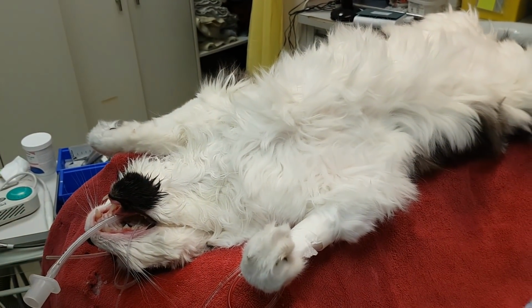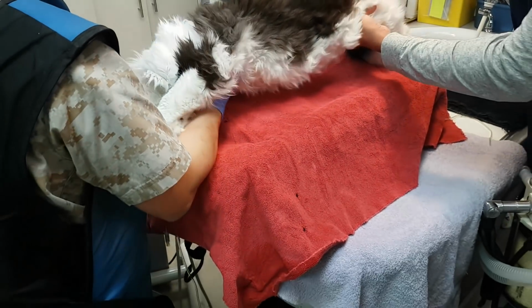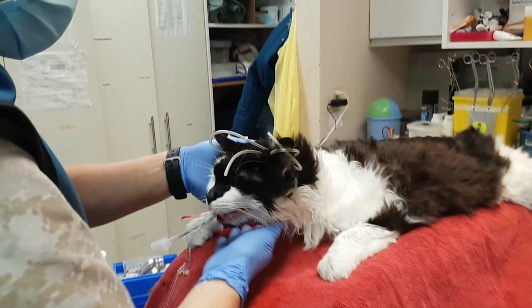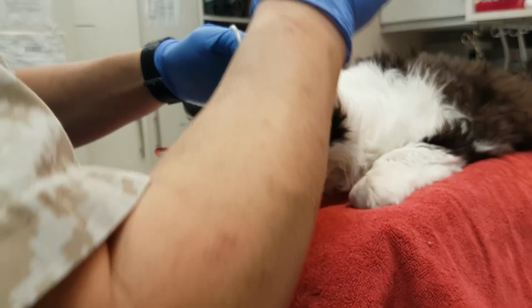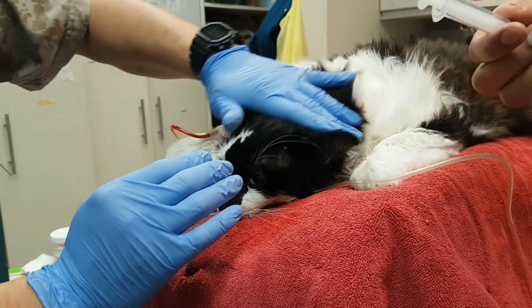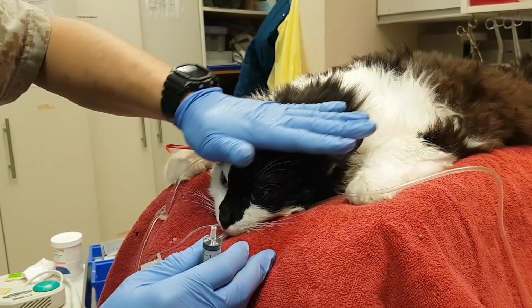Putting a cat or dog in sternal really maximizes their lung ventilation, so that's how I like to recover them. And again, here's where your premedicant protocol plays a big role. I like my patients to jump up within just a few minutes of us ending anesthesia. Some protocols may result in a patient waking up over 3 or 4 hours, but I like my patients to be up and about within about 5 minutes or so after we turn off the gas.